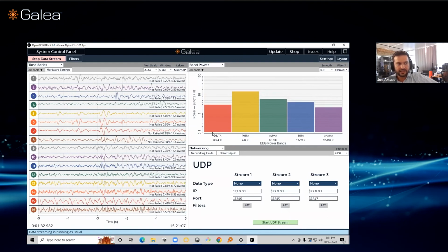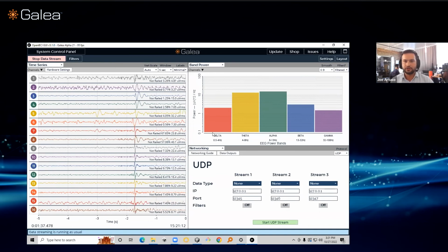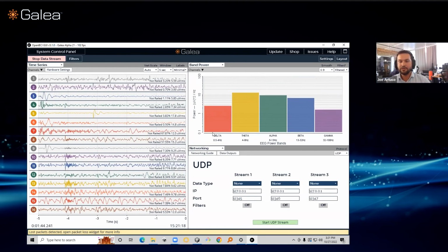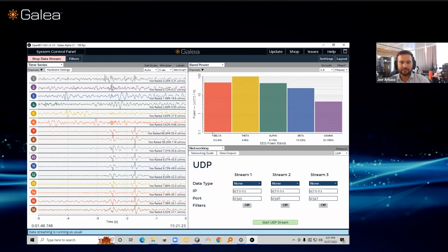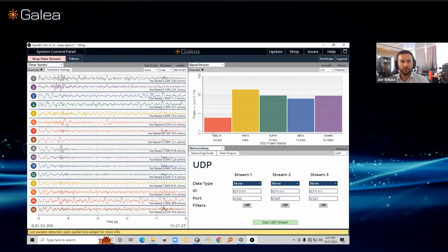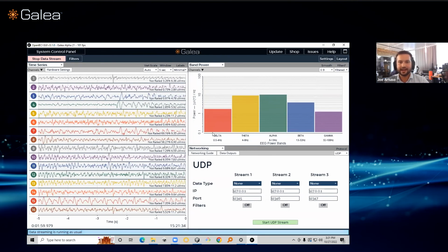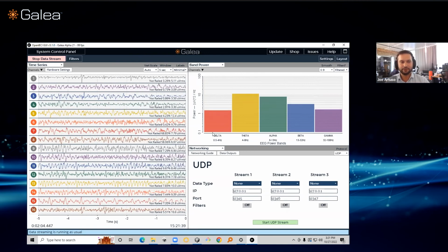What we've learned from years of putting this hardware into the world is we've started with the research audience, and that's moved into business, and then it starts to minimize down into consumer level applications once the science behind it has been proven. So right now we included every sensor that we could into a sensible hardware design, and are trying to get that out into the world as the Ferrari of development kits, for people to get started with.